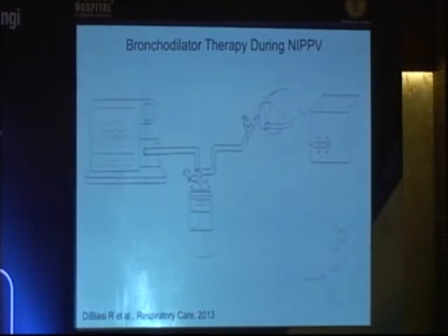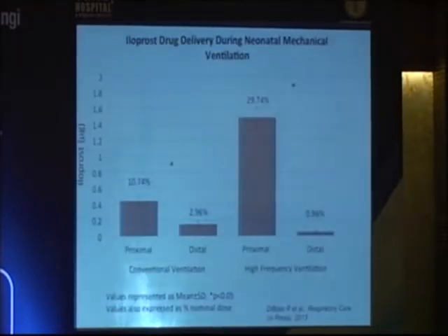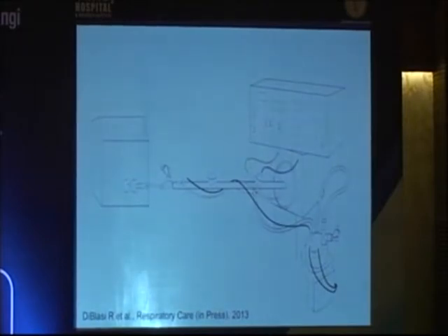So the other question, and keep in mind that the nebulizers that we use for every one of our patients that are mechanically ventilated now, it's not going to be a wet small volume nebulizer that's adding flow to the system. We're going to use a vibrating mesh nebulizer that adds no flow to the system, has really good particle size. If you have a little bit of additional money, they're nice to purchase. But if you don't, then settle with your standard nebulizer. And if you don't prefer to use that because the patient doesn't look good because they can't trigger the ventilator, take them off, bag your inhalers in. You're going to get 50% more. But if they really need that drug, it's okay to bag it in there. All right?